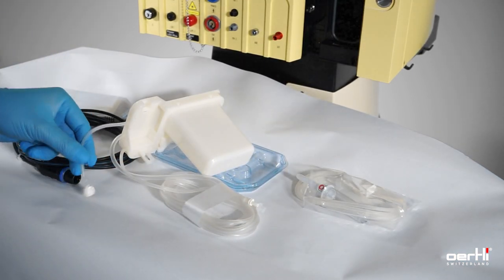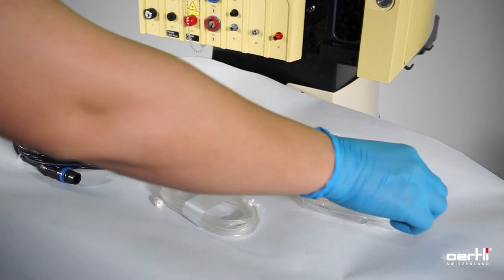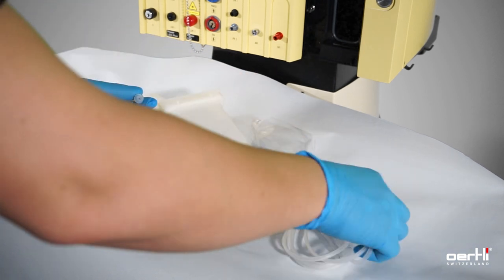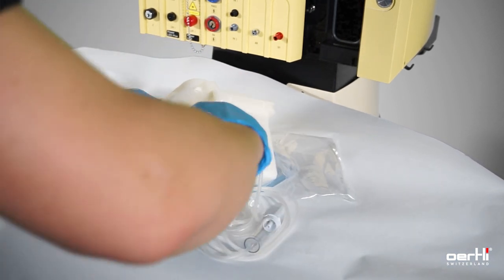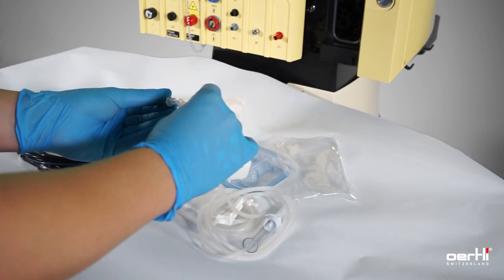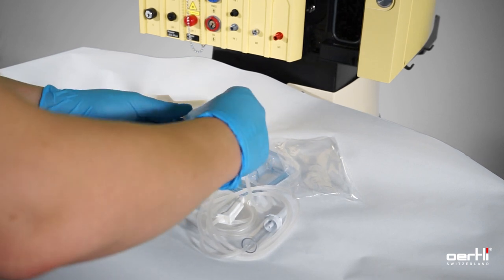Remove the cap here on the short tube, and remove the cap on the infusion line as well. Assemble by screwing.